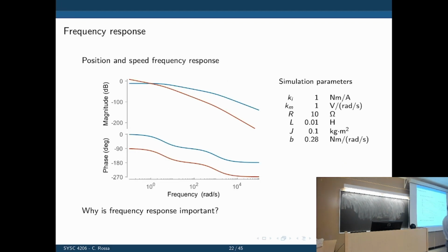So let's plot the bode plots of these. Why do we want to look at bode plots? What's the relevance with haptic feedback? The sampling rate, or how fast we can change directions. Ideally, we should be able to change directions very fast, but if there is too much friction, inertia, or other components in the way, we may not be able to do so because the dynamics of the system are too slow.